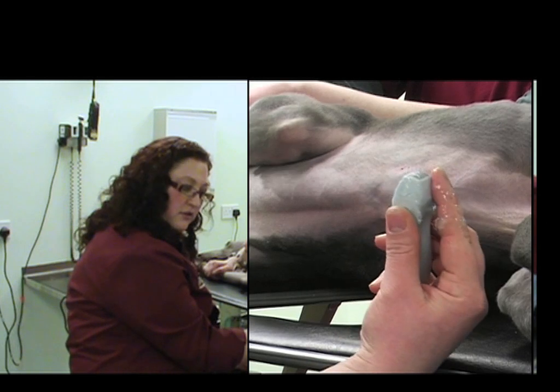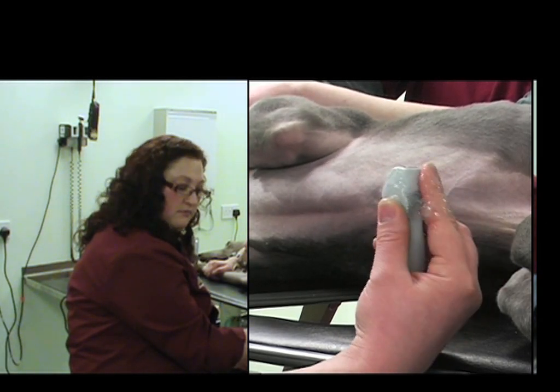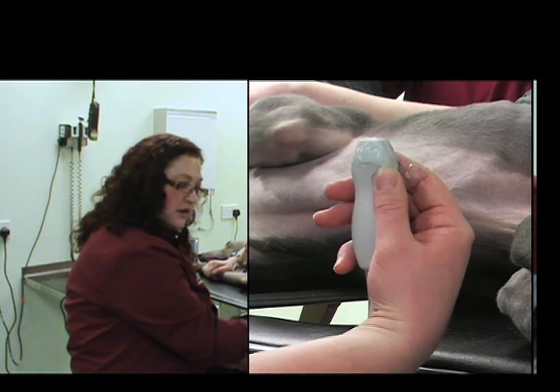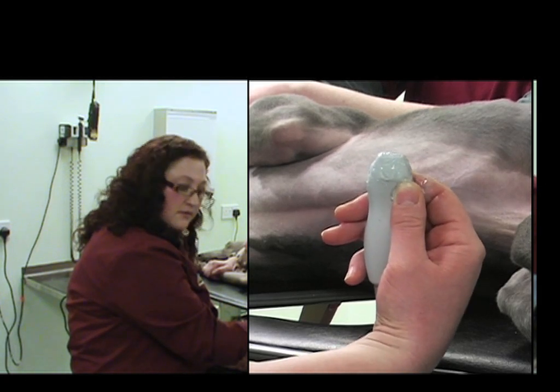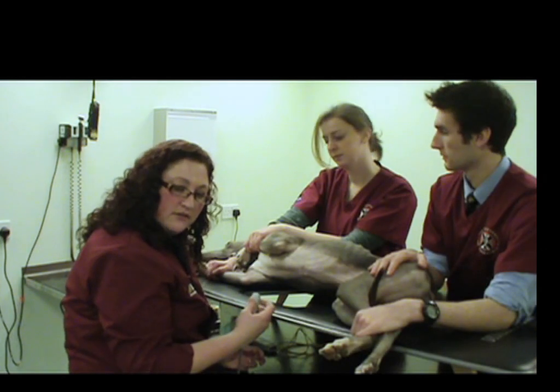In this orientation, we can fan cranially and caudally, or in other rotational movements. When we're looking at the short axis views, we can actually fan towards the head and towards the caudal end — the tail or the bum end. We'll have a look at what that does to the image just now.